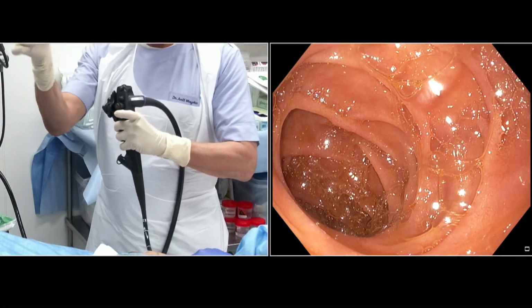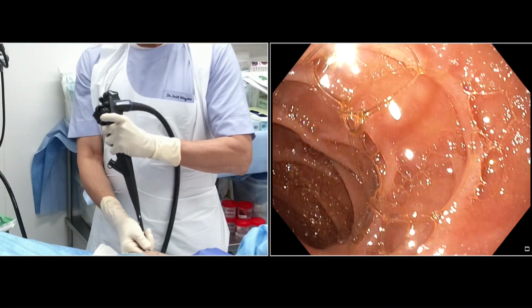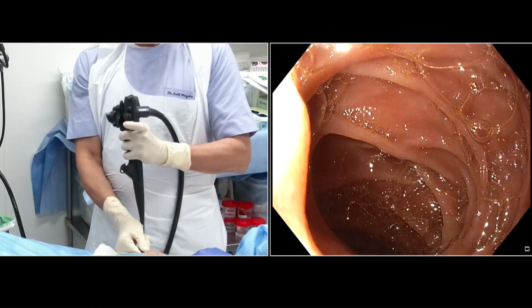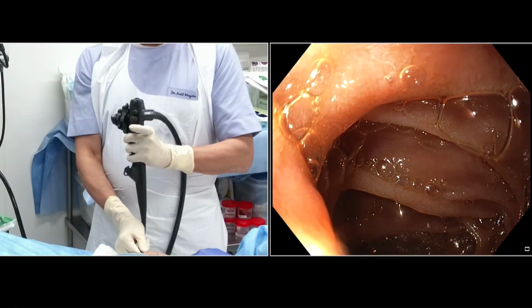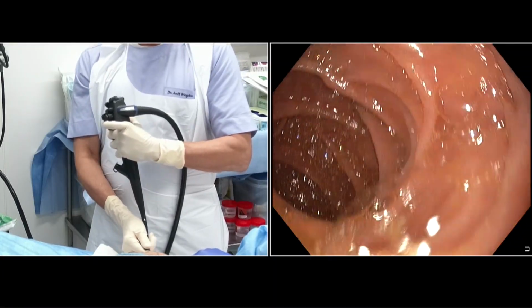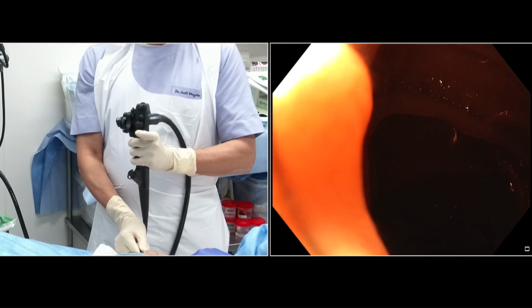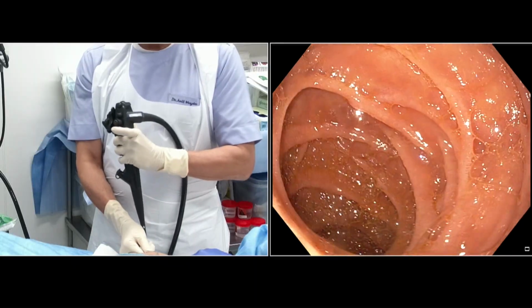So now the scope has turned the junction between the first and the second part, and on the left hand side you can see a small bulge there. That is the ampulla of Vater. That ampulla of Vater on an end viewing scope you will not be able to see properly, but you can see it as a bulge there. So now this is how we are recognizing we have entered the second part of the duodenum.